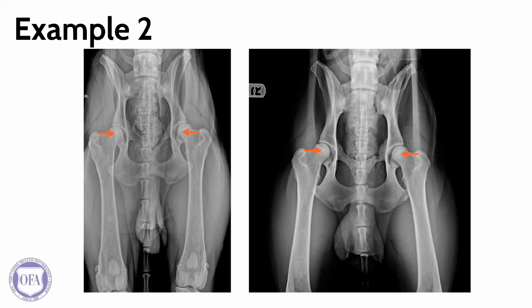On retake radiographs, the obturator foramen and ilial wings are improved in symmetry. The os penis is centered over the vertebral column. The spinous processes are very slightly left of midline. The stifles and patella are not included in this particular image.